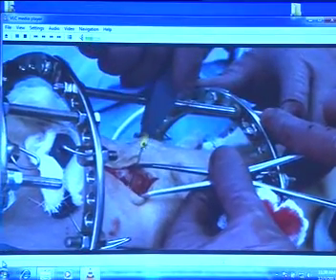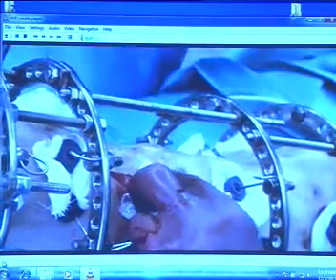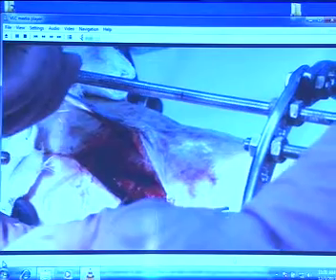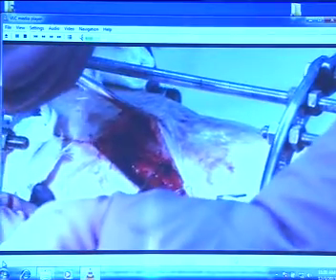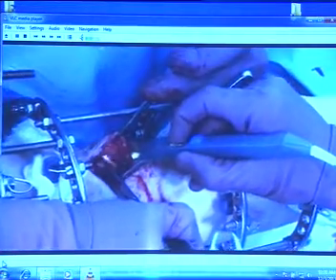Extensive scars on the skin and soft tissues are observed on the anterior medial aspect of the tibia. A bone defect is exposed layer after layer. Bone ends are separated from scarred tissues. Due to evident sclerosis, the bone is pre-drilled along a resection line in the proximal fragment, to be followed by economic resection and hemostasis.